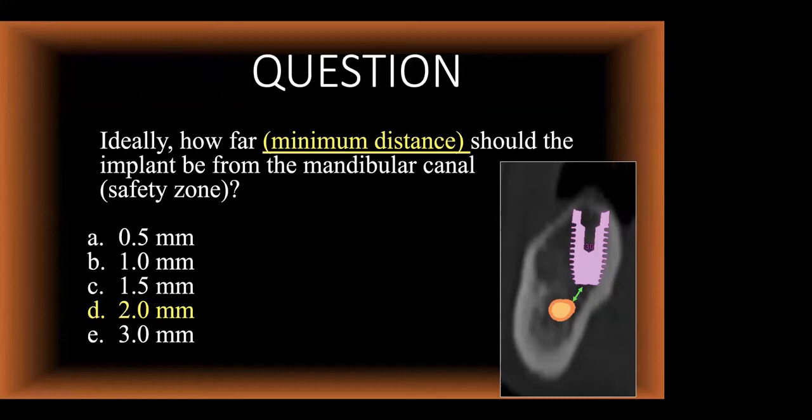Well, number one, remember, most burrs that we use, surgical drills, have a Y dimension, which means if you're drilling 14 millimeters, you're actually drilling more than 14 because the drill is longer than the length of that implant. So you always have to drill deeper, and that's just the engineering design of the actual drill.